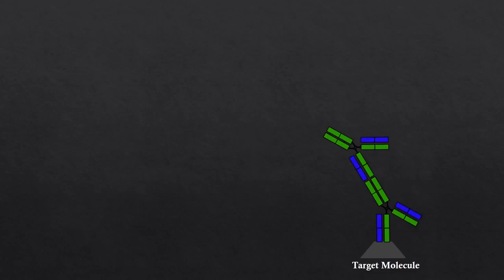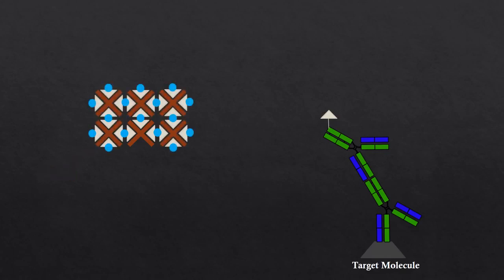Another common method used in IHC is known as the avidin-biotin complex method, or the ABC method. When researchers realized that the indirect method did not provide enough staining, they attached a lattice full of labels to the secondary antibody to make sure that the stain was visible. A molecule called biotin was attached to the secondary antibody to anchor the lattice. The lattice itself is made up of avidin molecules with 4 biotin molecules surrounding it. The biotin molecules attach to label molecules, which in turn attach to more biotin molecules.